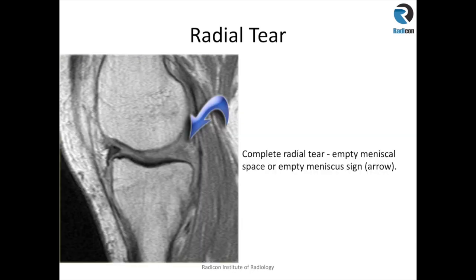Here is an example of a ghost meniscus sign, also called an empty meniscus sign. We are on the medial side of the knee — this is the anterior horn of the medial meniscus — but you cannot appreciate the posterior horn of the medial meniscus; it is absent. This is a classic example of a radial tear.